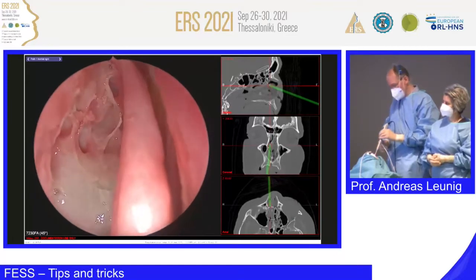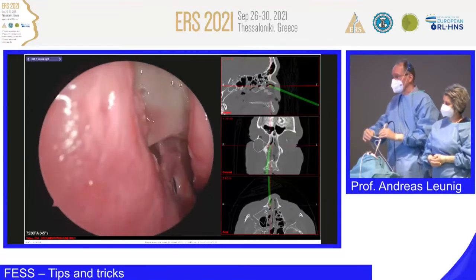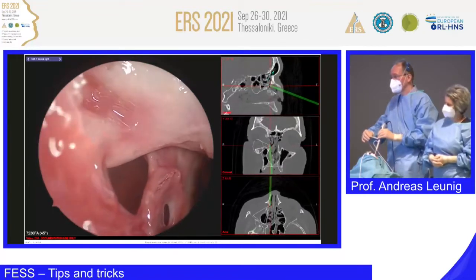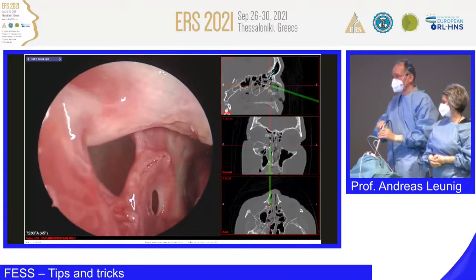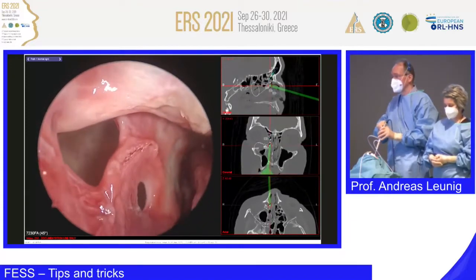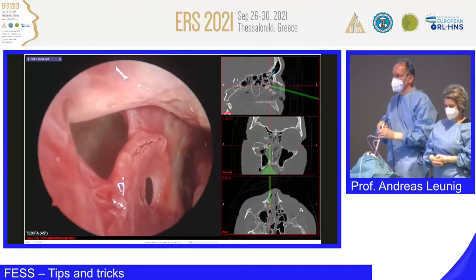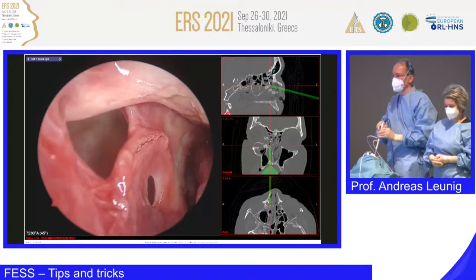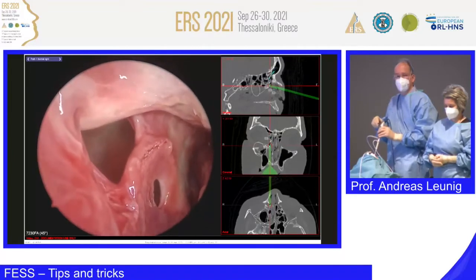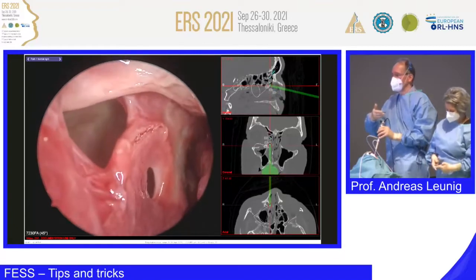Now, I turn around the endoscope very easily, and I want to look for the maxillary sinus opening. That's a natural opening. And what you see are two openings. And now, in case there's an indication to open it, but I don't know what's the best size, usually I try to expose the natural ostium, and then it depends on the pathology.